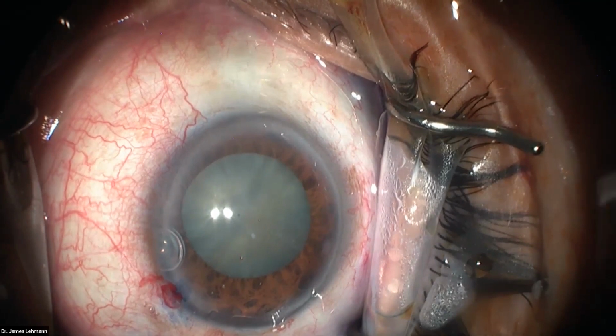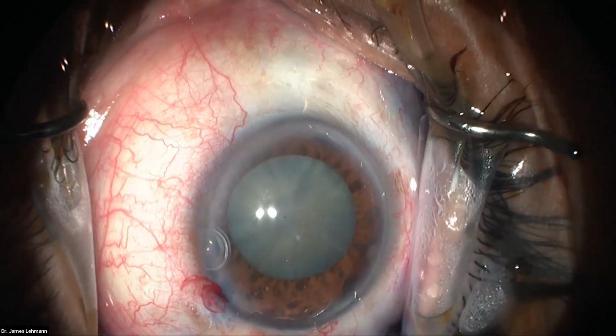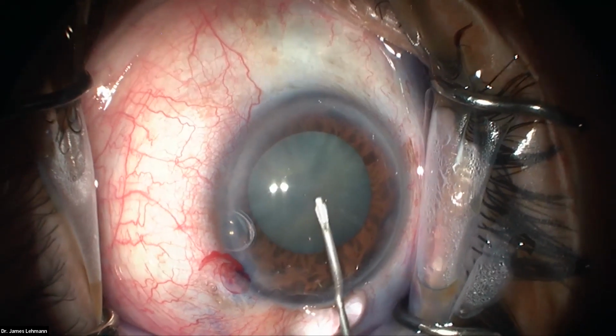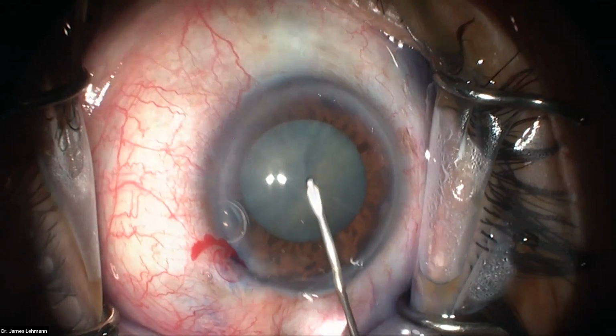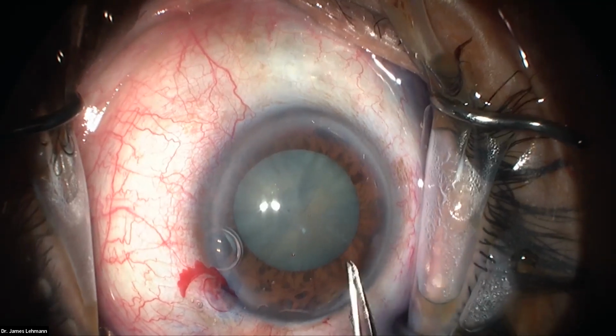Okay, now we're talking about the Rexis. So this is a delicate part in the mature cataract. So what I'm going to do is start small because sometimes there's some pressure in here and it's going to want to go out a little bit. So I make a nick, I go across, and I'm starting kind of small. Now this looks like it's going to be a dense cataract, not the soft kind. The soft kind, you'll see a lot of cortex fluffy stuff come out, but we'll still start out small here.